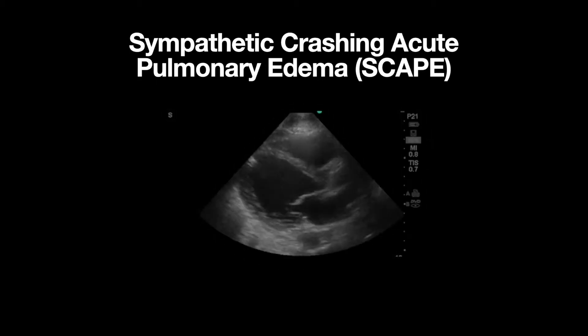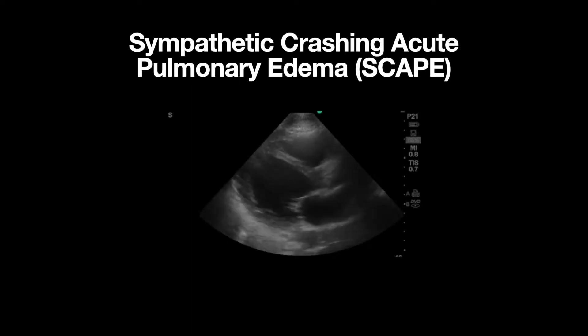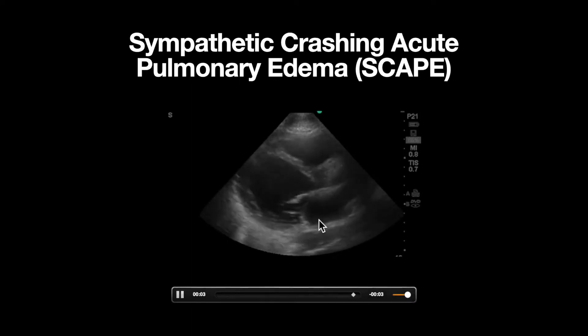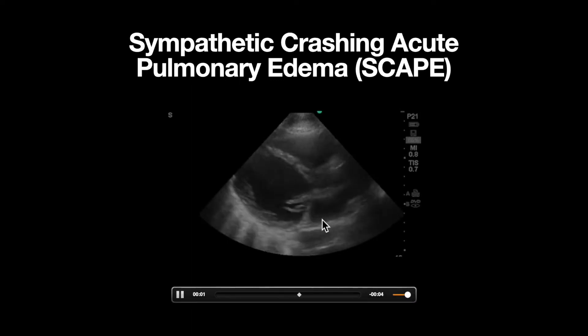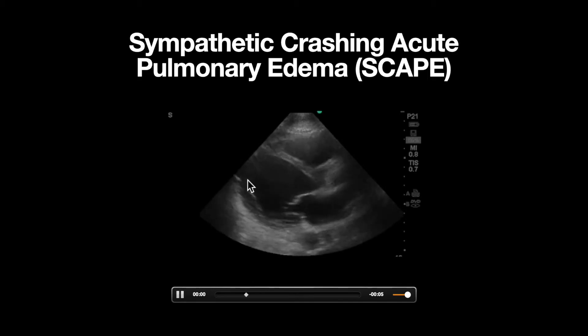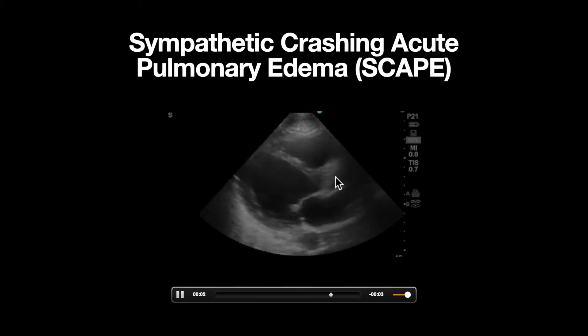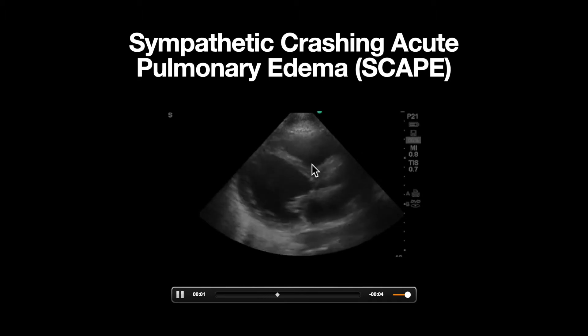In our parasternal long axis view, a decreased ejection fraction is appreciated. The left atrium can be seen here, mitral valve, left ventricle, aortic outflow tract, and right ventricle outflow tract.